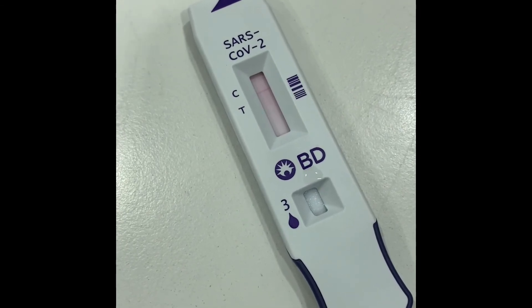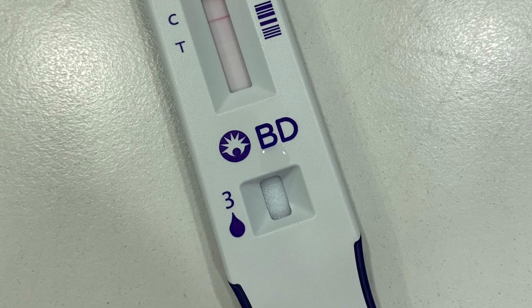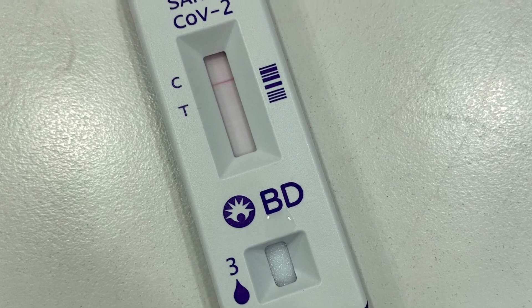If you see the line appearing at T only, your result is invalid, so you have to take the test again. Thank you very much for watching, stay safe, bye bye.